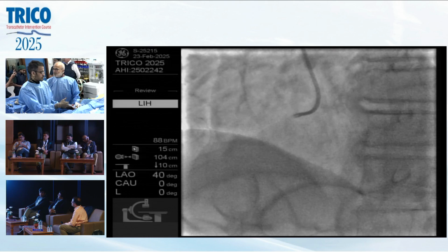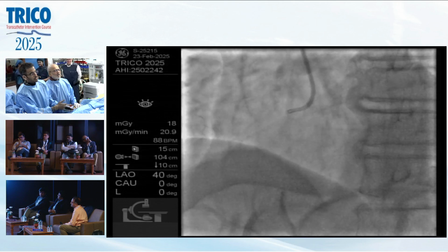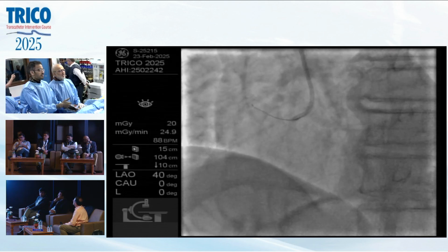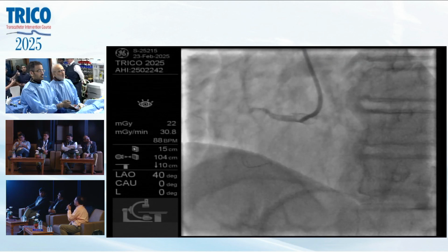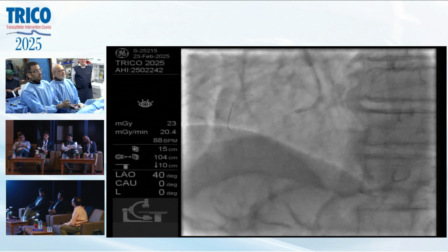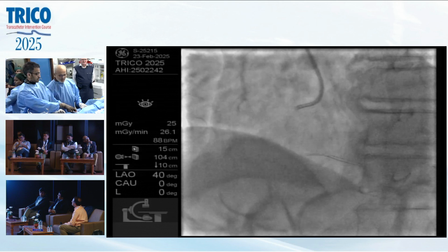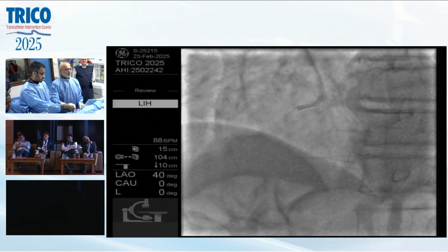What about the mid-RCA lesion? Do you think it is not significant? RCA has a lesion. Wouldn't we fix it first, then go for the anomalous? How many of you think that it is significant? I think it's borderline. I would probably leave it alone. If you go as per the guideline, the FFR will be 0.9. But let us see. We'll check it in the other views also.